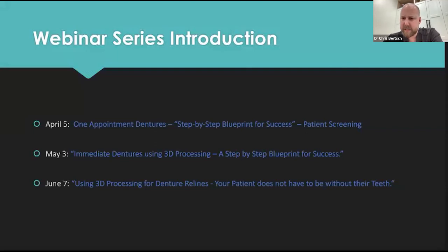Small dots that you can still capture some tissue better. Oh, I've never heard of the small dots. Actually, yes, that's true. I've also used the indelible stick if there's an area that's difficult to capture, and I'll just use that indelible stick and kind of paint the tissues a little bit, and then it helps capture it. So yeah.